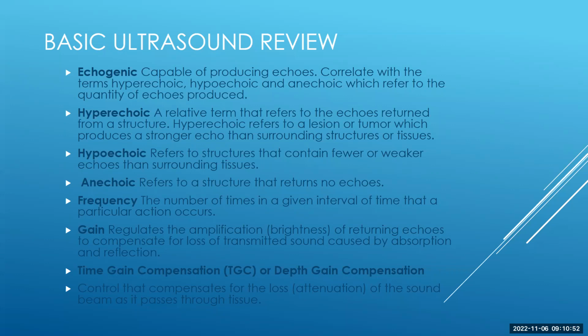So we do want to be mindful, if something is a deeper structure, we want to lower the frequency. Think about it as the sound having time to get down to that depth and return in order to create a good image. Versus if it's high frequency and it's a shallow or superficial structure you're looking for, it's okay to send a whole bunch of sound waves because it's going to return relatively fast, and you would have a very clear, high resolution type image. Gain regulates the amplification or the brightness of returning echoes.